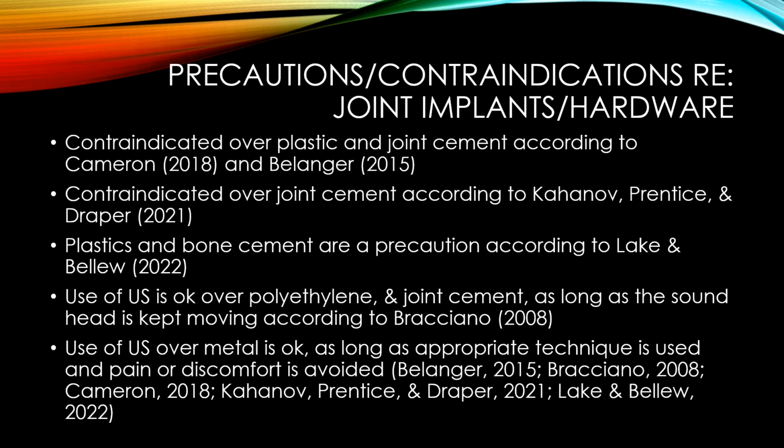Now I want to talk about a couple of areas where there's less agreement about the precautions and contraindications, or there's some discussion anyway. So on this slide, we're going to talk about joint implants or hardware. Cameron and Bellinger both say that therapeutic ultrasound would be contraindicated over any plastic joint implants and any joint cement. Kahanoff, Prentice, and Draper say therapeutic ultrasound is contraindicated over joint cement. Plastics and bone cement are a precaution, according to Lake and Bellew.